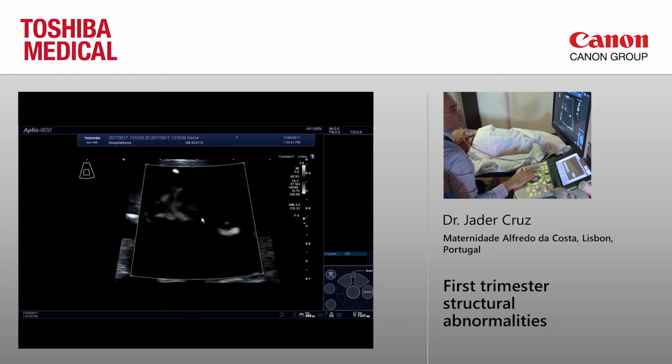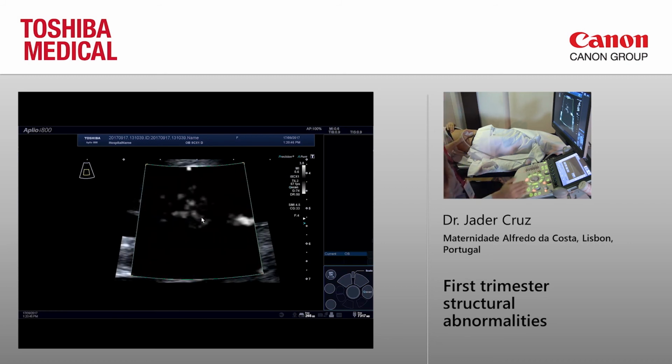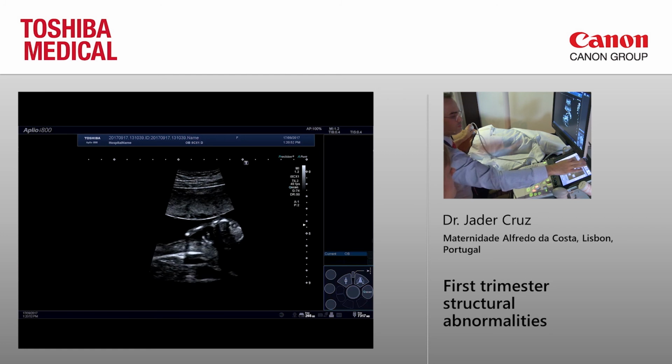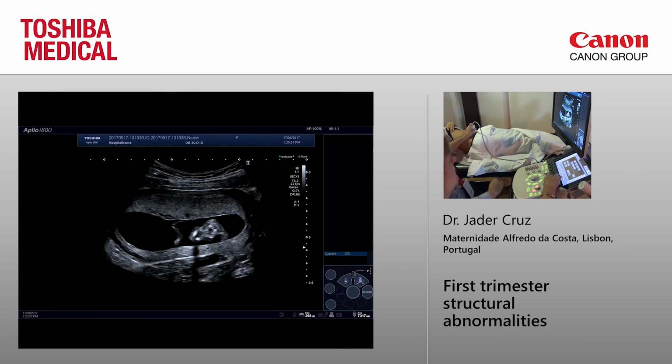Do you have any questions? Yeah. Any questions? While Dr. Cruz is still with the transducer on the baby, something you want to see specifically? No? Ah, there was. Okay.